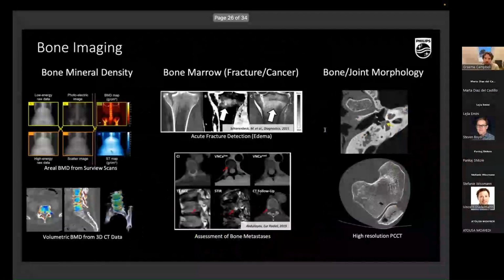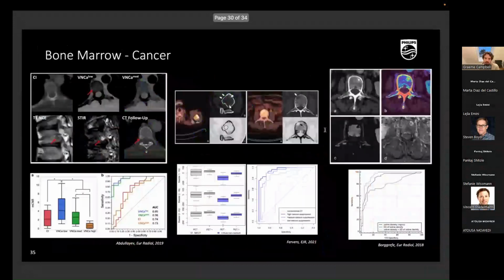They looked into that in Cologne, and looked at, for example, a low level, which actually corresponds to a lot of suppression, versus a medium or a high. With quite a lot of calcium suppression, they could really see and delineate the metastases, and they could characterize them much more accurately in terms of sensitivity and specificity compared to conventional imaging.